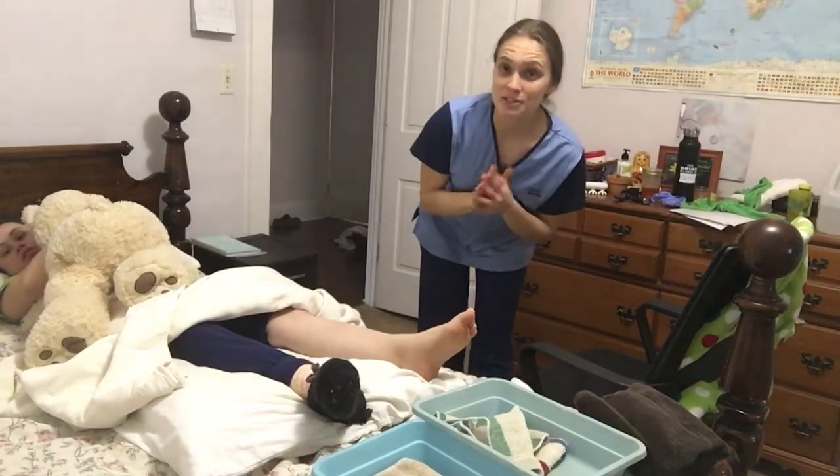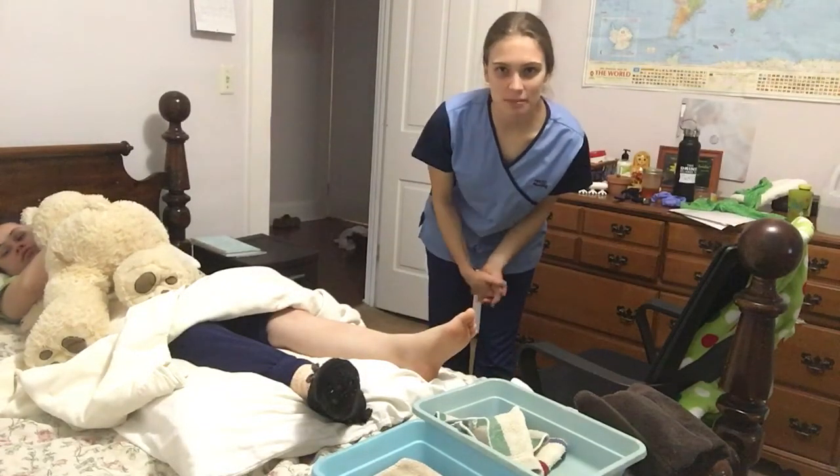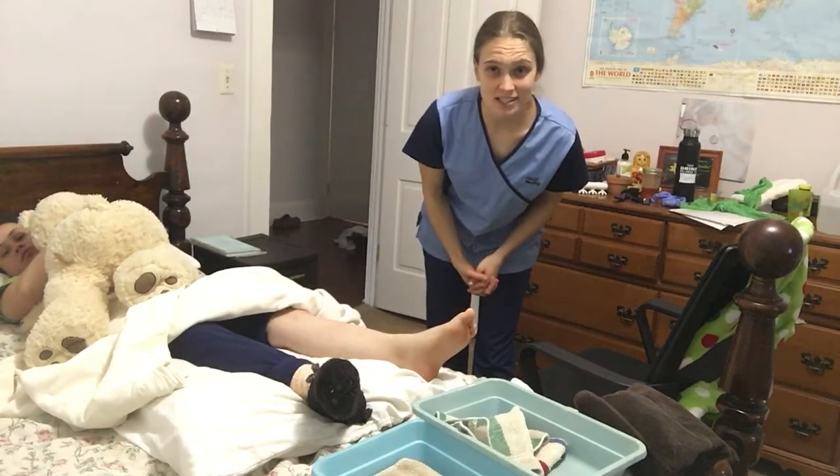Hi, my name is Faith Boysen. I'm a student nurse at HACC and I'm going to be demonstrating how to apply TED stockings.